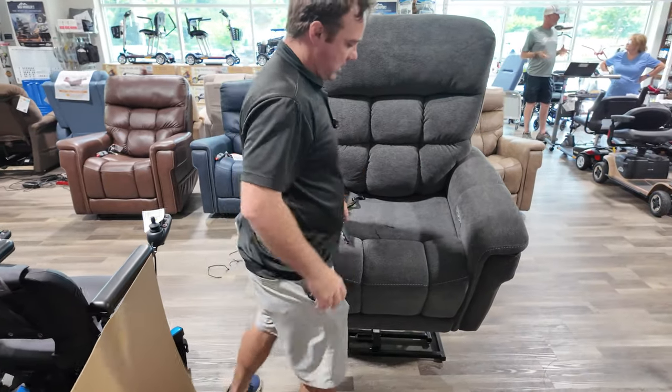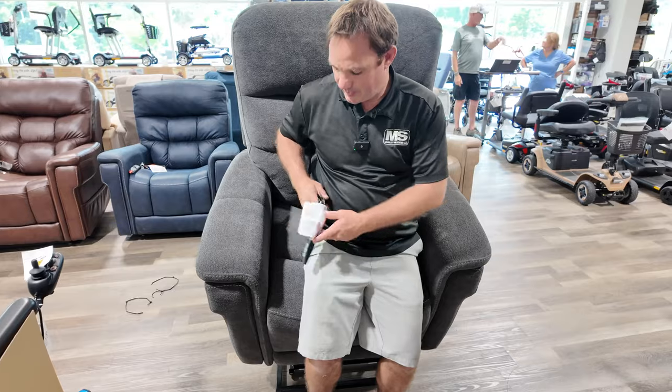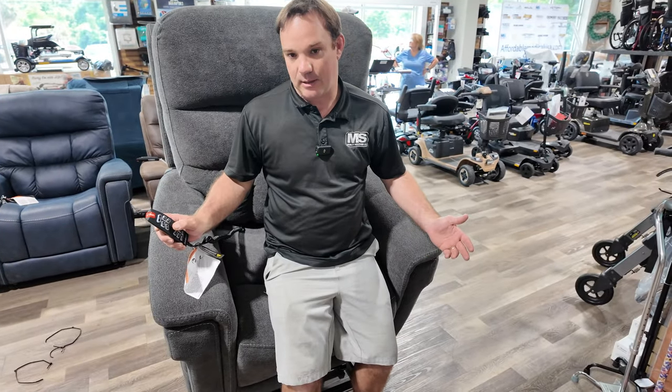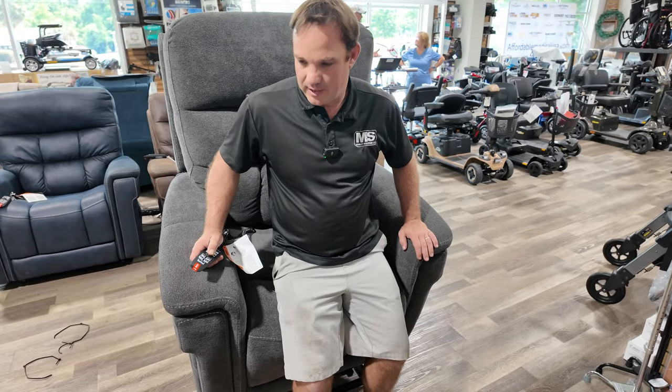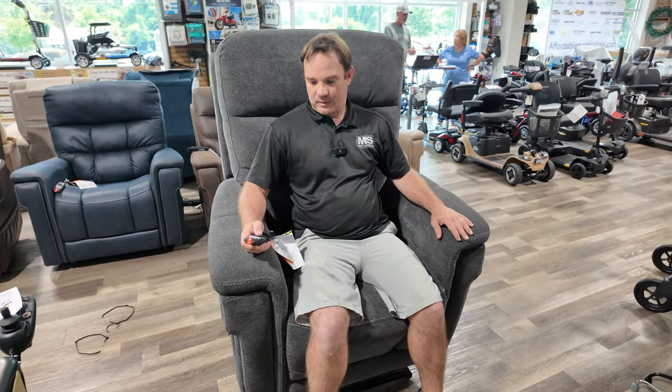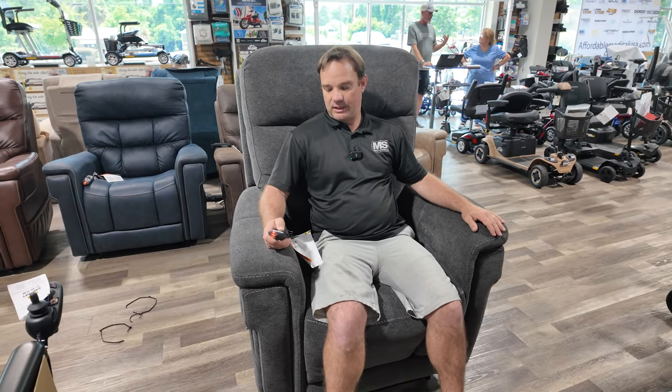Get into the chair right here — sit down. If you plop into it, make sure you press the down button; it's going to bring you down. This is the large — it's too big for me. We're on the battery backup so it might be a little bit faster when it's plugged in.